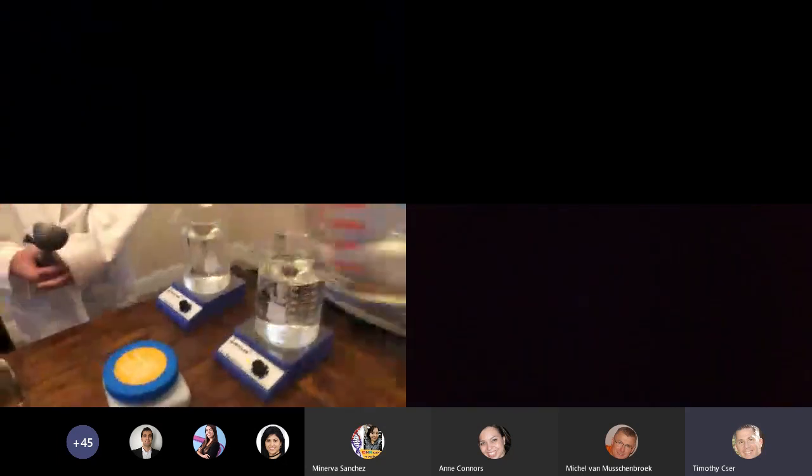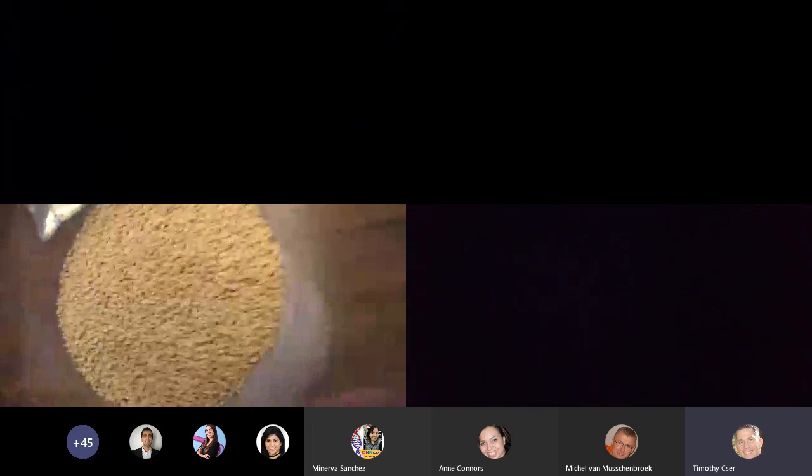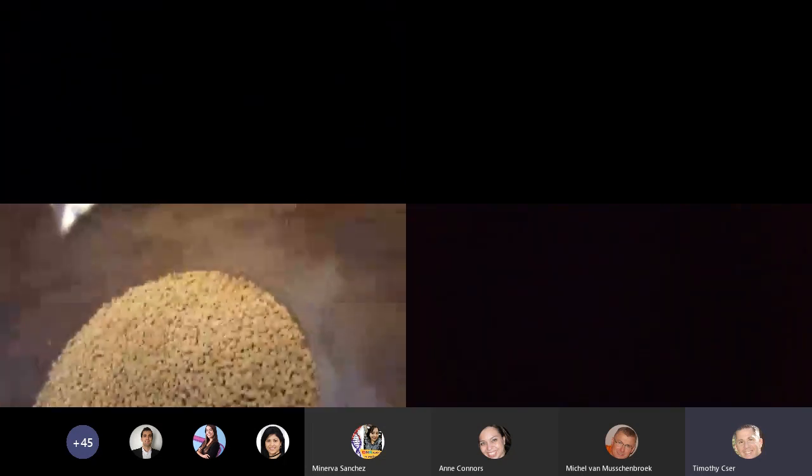Well, here is our demonstration today. We have two stir plates. We've got some powdered media and we've got some granulated media. I'm going to get up close on this granulated media so you can see the difference between that and powdered media. Okay, great. So we're going to start with Whitney.